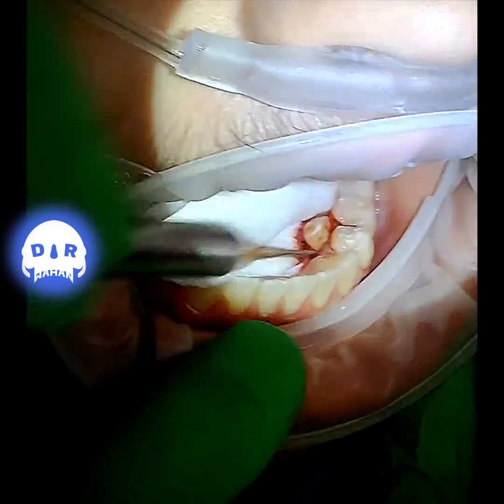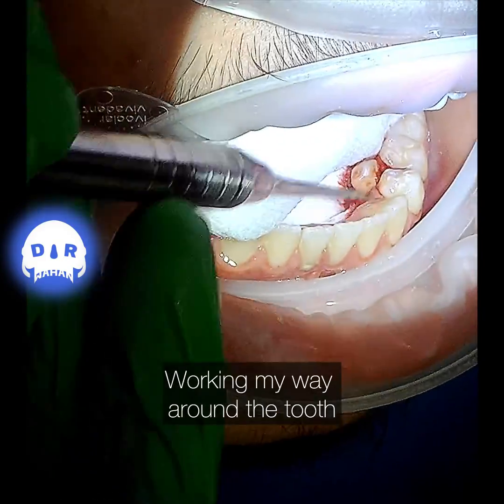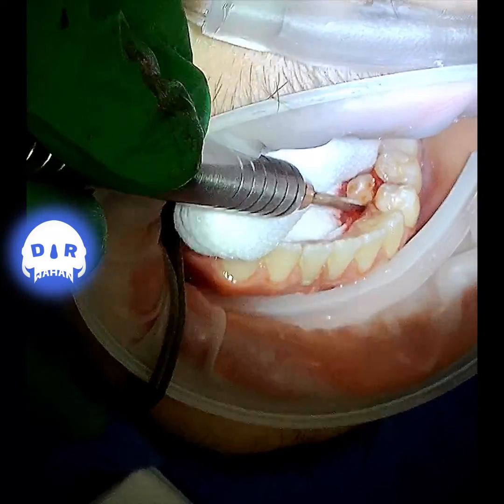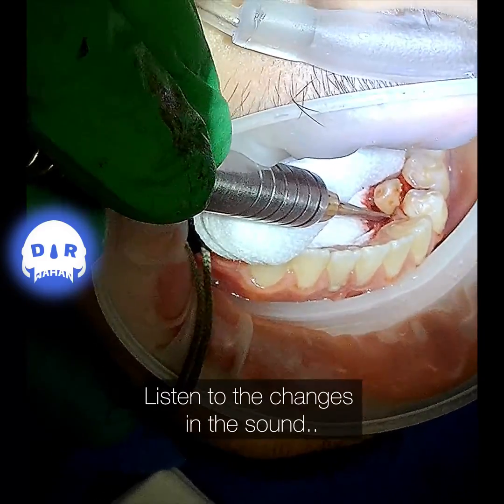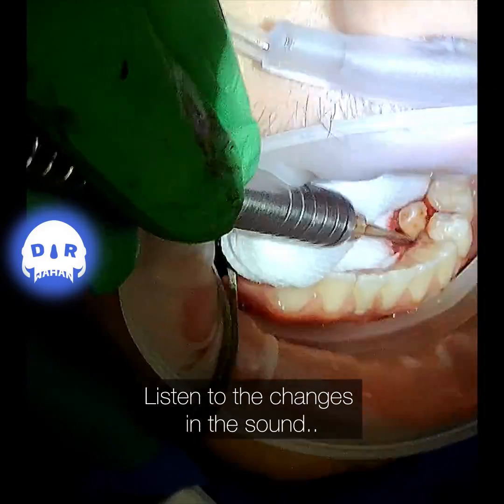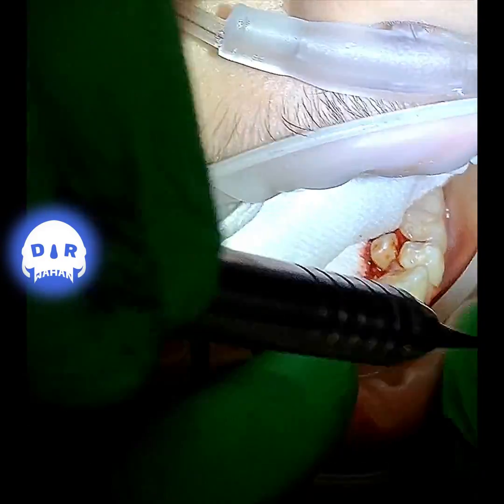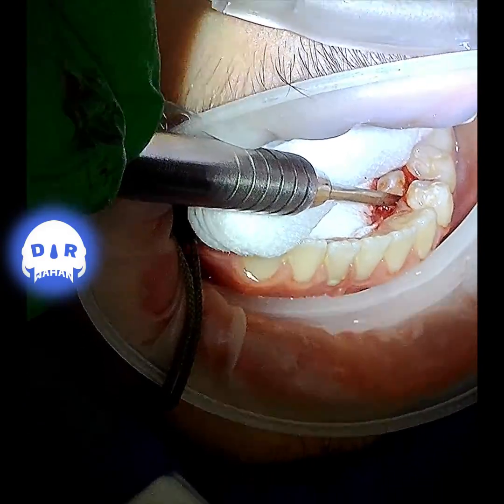Now I'm going to break out the periotomes and mallet — basically like archaeology — just tap, tap, tap to create a little space and work my way all the way around the tooth. Believe it or not, this is less traumatic than taking a handpiece and getting in there.